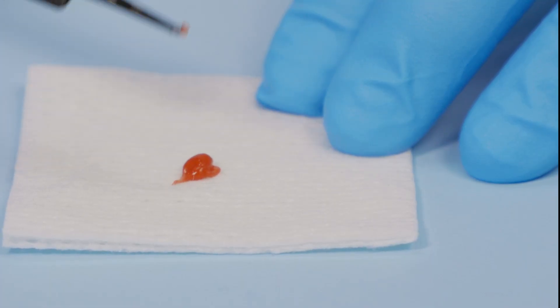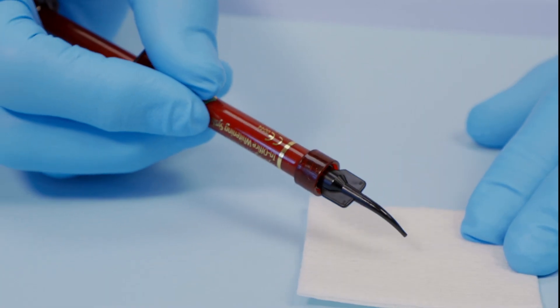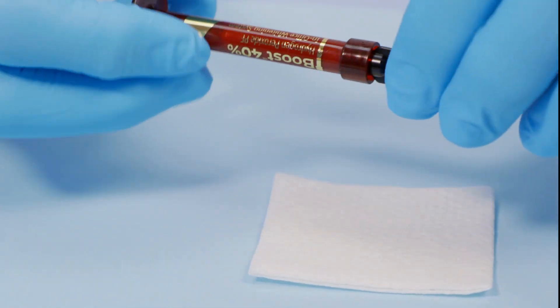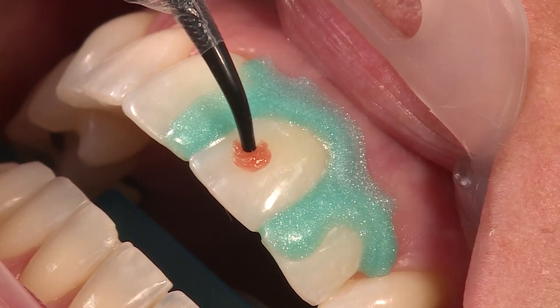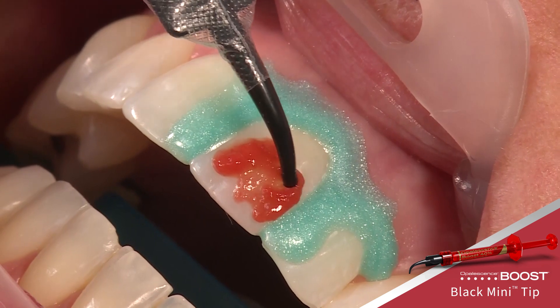Verify flow prior to applying intraorally. If you feel any resistance, do not proceed. Attach a new tip and test the flow again before applying Opalescence Boost whitening gel to the teeth. Apply a 0.5 to 1 millimeter thick layer of gel over the labial surface.